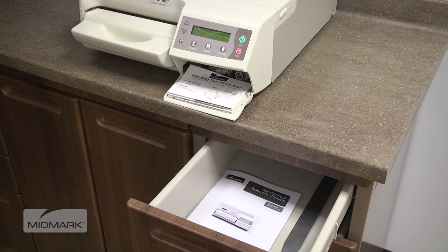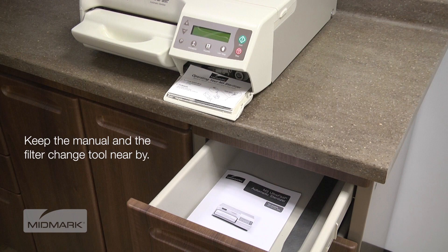Place the manual in a location near the sterilizer or, if possible, permanently affix it to the sterilizer.